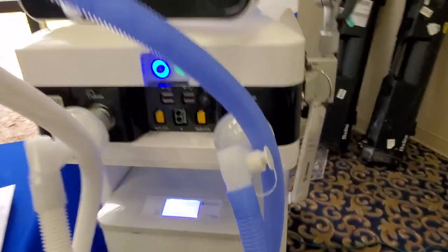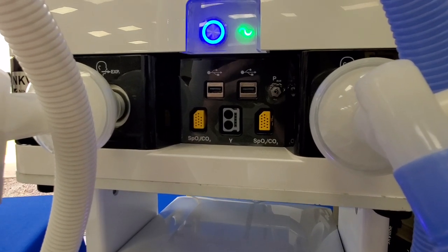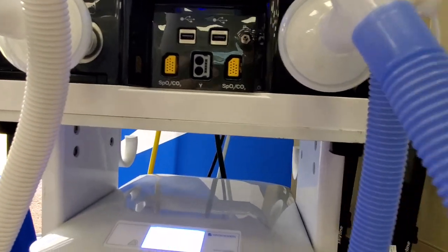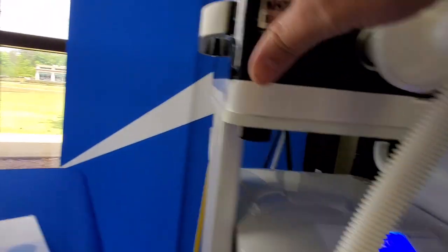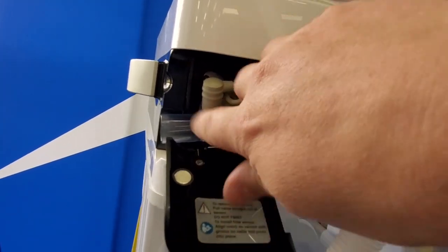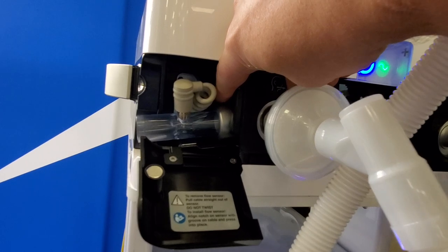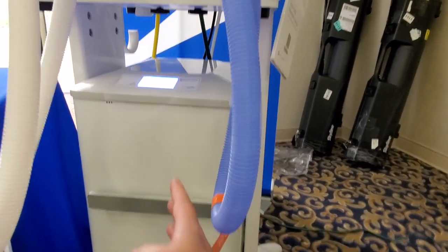But there are some really cool features on this. Take a look at the front — we have SPO2, we've got carbon dioxide, and notice how quiet it is. This thing is actually running right now. On the flow sensor, it's got a traditional dual-wire flow sensor, a lot like the Draeger, but it's got a heated block in here so it prevents moisture build-up. Very cool, very interesting.